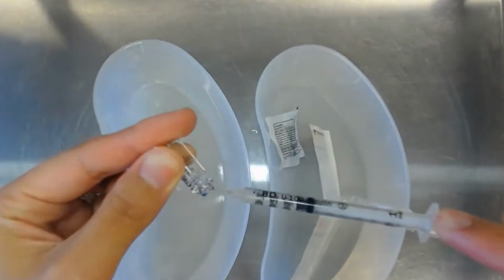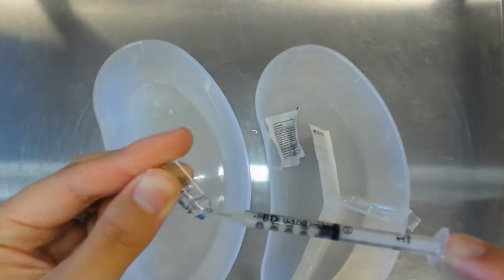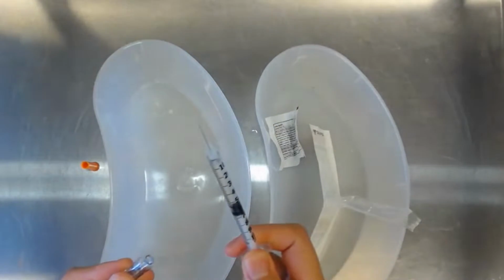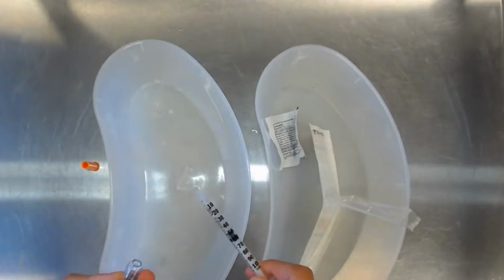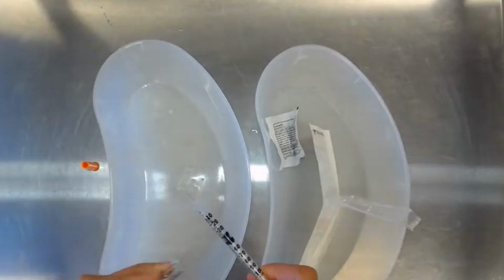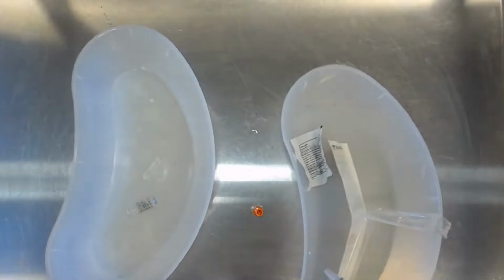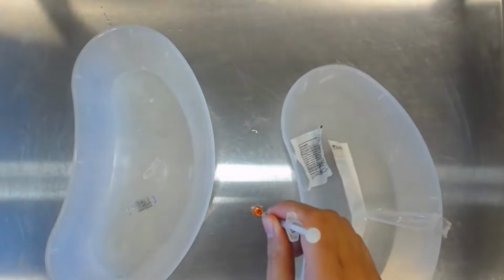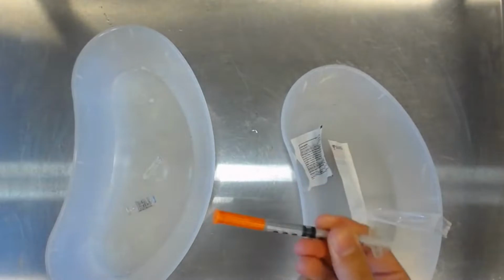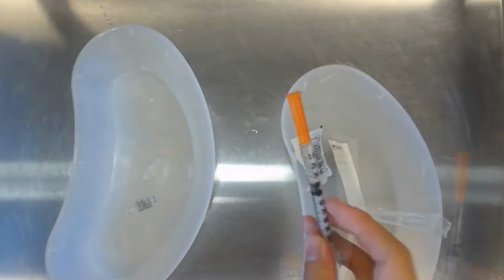Expel excess air bubbles. Remove the needle from the ampule. Hold the syringe with the needle pointing up. Tap the side of the syringe to cause bubbles to rise towards the needle. Draw back slightly on the plunger and then push the plunger upwards to eject air. Do not eject medication unless it is excess medication to what has been prescribed for the patient.